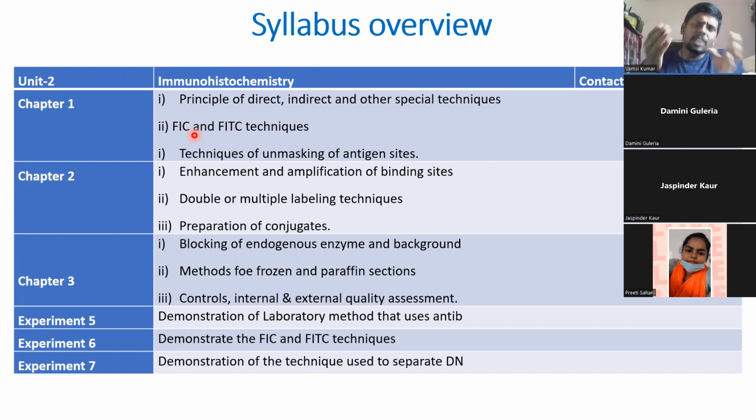For that purpose, we will suspend the tissue for a brief period of time in human serums or some other monoclonal antibody solutions to block the endogenous activities, blocking some substrate activities. They can be peroxidases, they can be some antigens also. So there is this step called blocking.